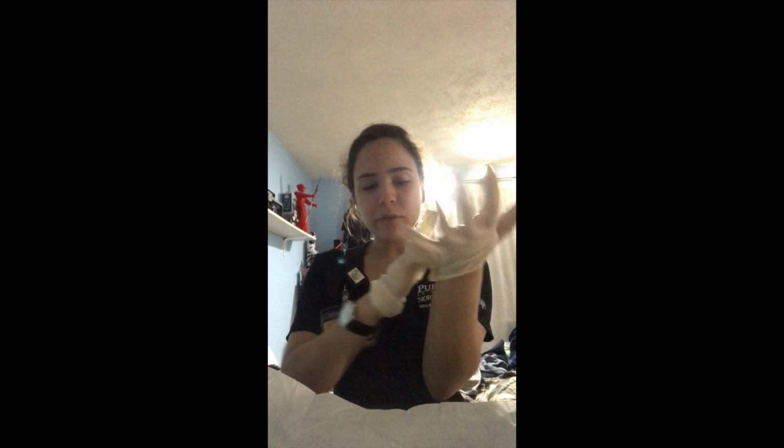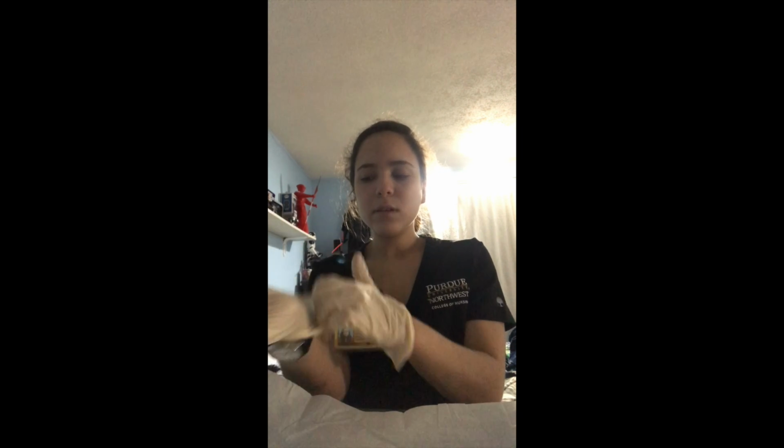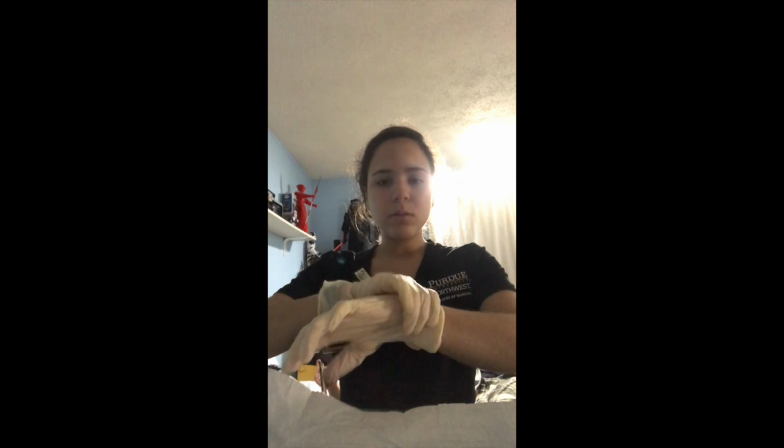Now I can fix the gloves, but just touching the sterile part of the gloves, sterile with sterile. So I can fix it in case it went wrong, and make sure that it's sterile with sterile. So I have my gloves clean, so sterile.